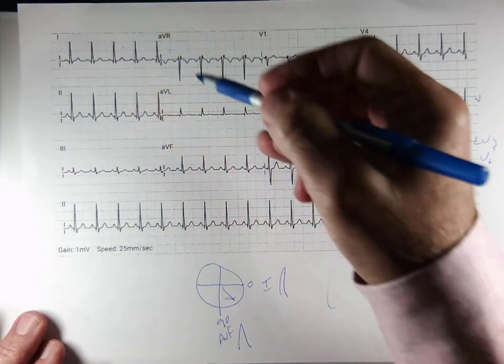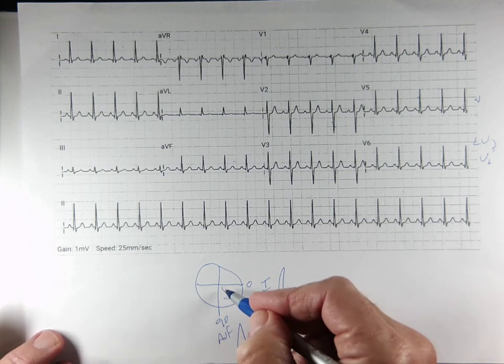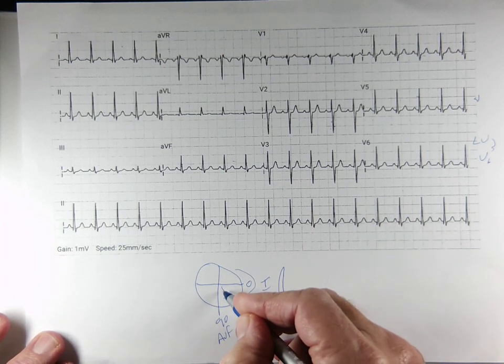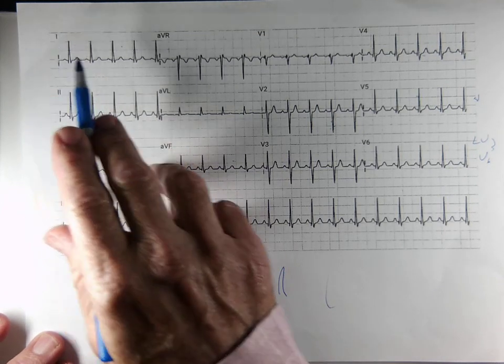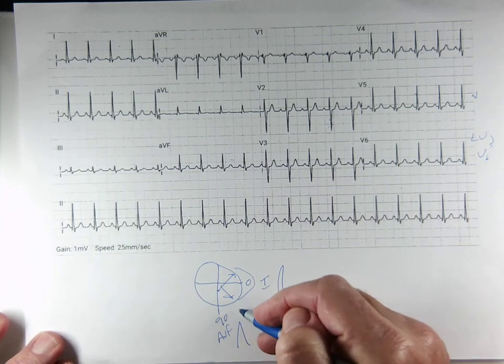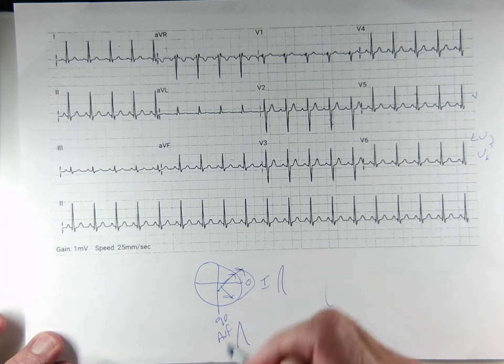So lead 1 and lead aVF are how we look for what we call the axis of the heart. And this came up, people want to know how you determine the axis. That's just all the electricity heading one way. Okay. Now, if you had more left ventricle, one of the hearts in lab has a bunch of hypertrophy. And so when it depolarizes, it's still going from the right arm to left arm because it's a lot more left ventricle heading towards the left. But instead of heading towards the feet, there's more LV up here and it's heading up towards the left shoulder.